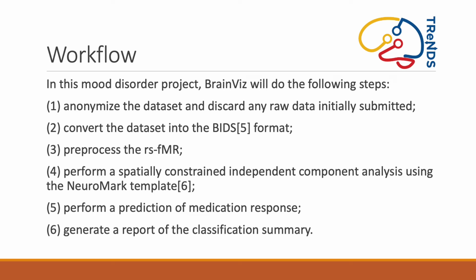Following the conversion to BIDS, the data set will be pre-processed using a pipeline configured for resting state fMRI. Next, the results of the pre-processing will serve as the input into a spatially constrained independent component analysis using a specific template called NeuroMark, which is described elsewhere.